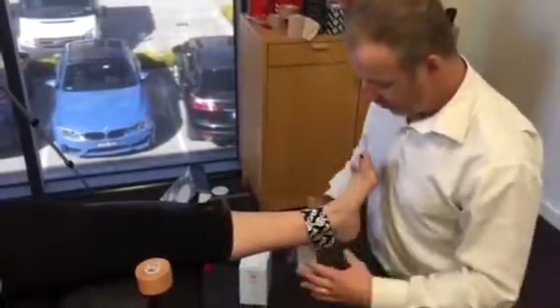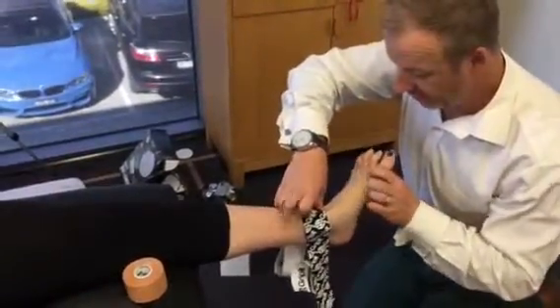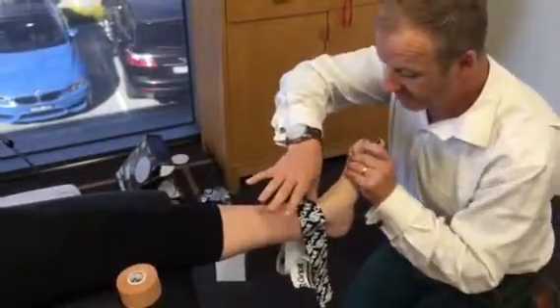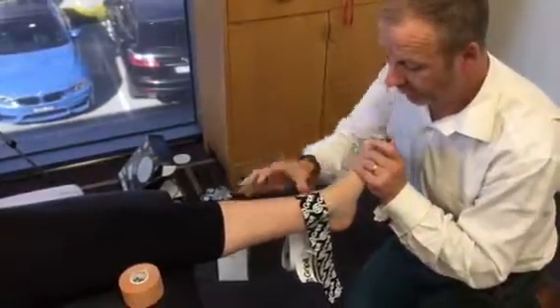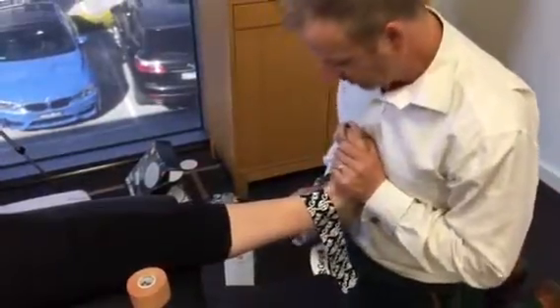So if you bend your ankle joint up and down for me, Amy. The tibial plafond here is where the tibia ends and the talus starts. We're just above that area, which is perfect for what we want to do. Amy just puts her foot — not all the way up, maybe just a little bit off stretch.